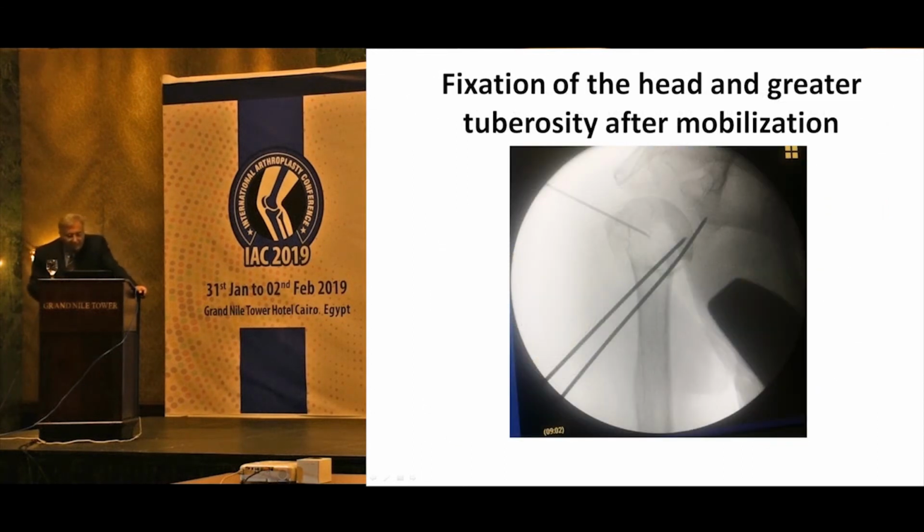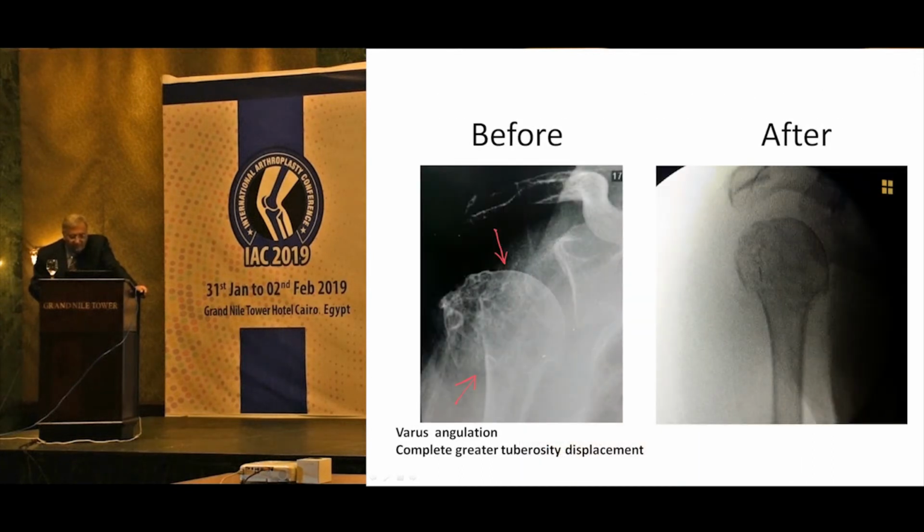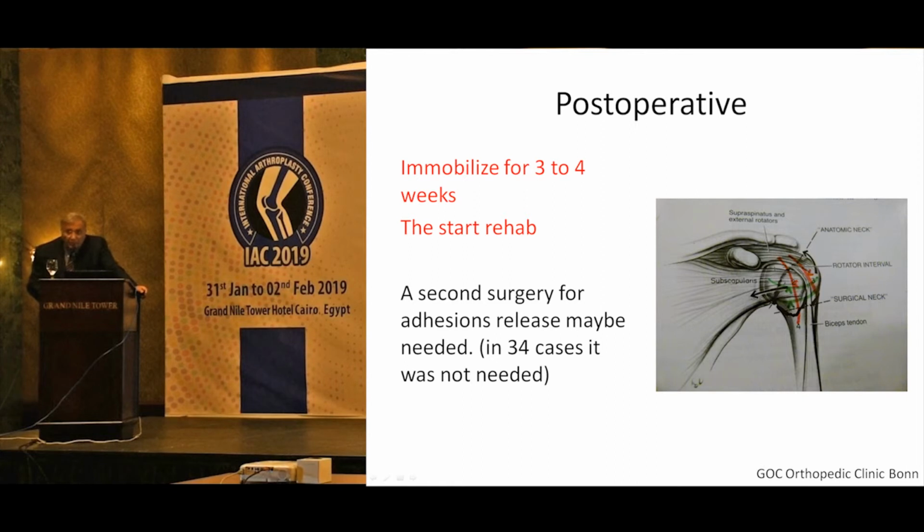Here we see the X-ray showing the fixation of the head to the shaft, and here by passing the giant needle through the tendon and then making the reconstruction. Before, we see the greater tuberosity is displaced markedly and the head is tilted, and after that we have the head in an approximately normal position and the greater tuberosity reconstructed in its place. Post-operatively, we immobilize the shoulder for 3 to 4 weeks, then start rehabilitation.